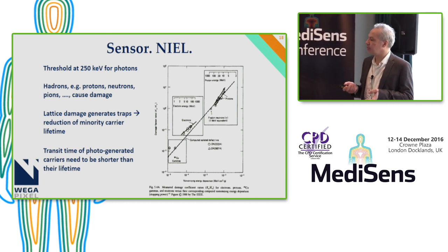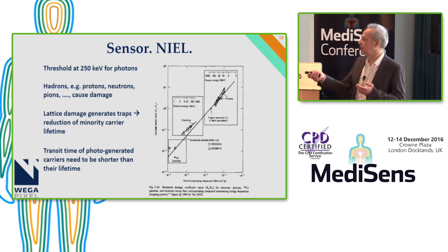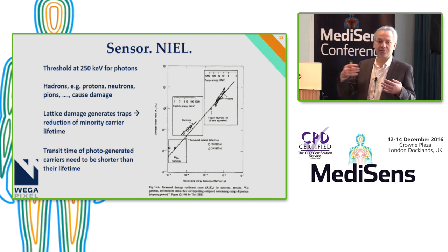But we have to take care of this type of damage, and what do we want to do? What happens to the silicon, and how can we somehow manage this damage? An important thing is that when the silicon gets damaged, the electron hole carriers get trapped more quickly. With increasing damage, they get trapped more and more quickly. So the solution is to try to get them to the right place before they get trapped. For the silicon device, this means collecting the charge very quickly, and the way to do it is putting in an electric field, which is not commonly there in an image sensor, not everywhere at least.